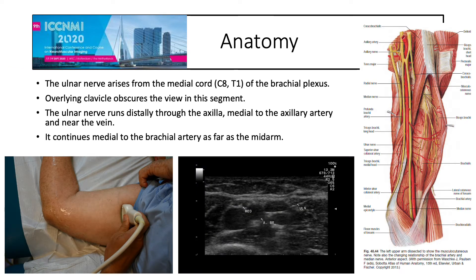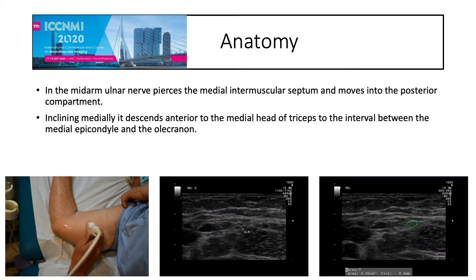The ulnar nerve arises from the medial cord C8 to T1 of the brachial plexus. The overlying clavicle obscures the view in this segment. The ulnar nerve then runs distally to the axilla, medial to the axillary artery and near the vein. It continues medial to the brachial artery as far as the mid arm. You can see the position of the probe here proximally in the arm — the structure here is the ulnar nerve, here is the brachial artery, and these are the surrounding veins.